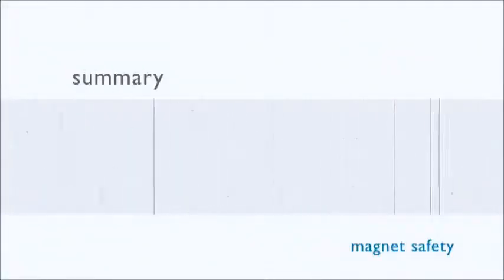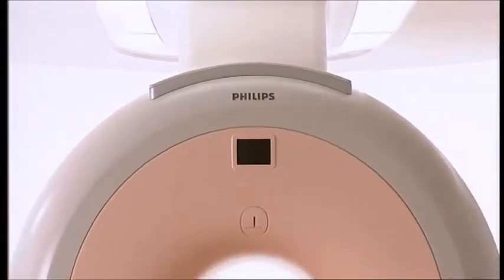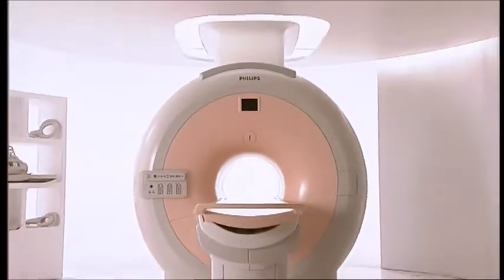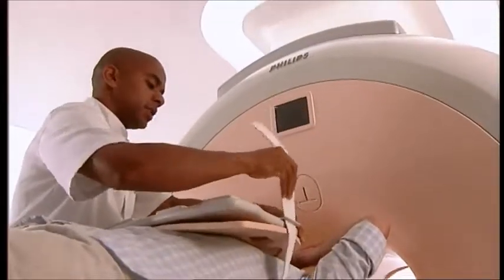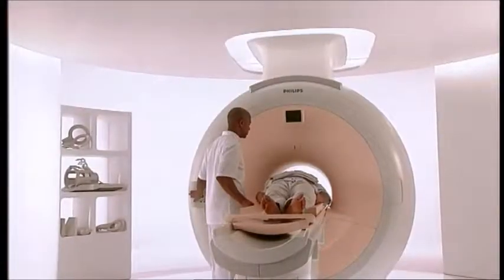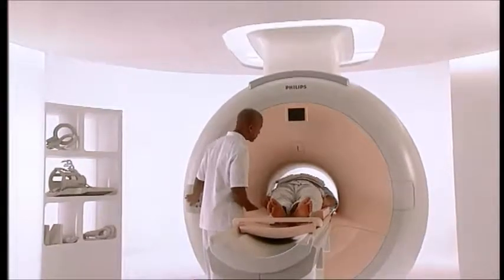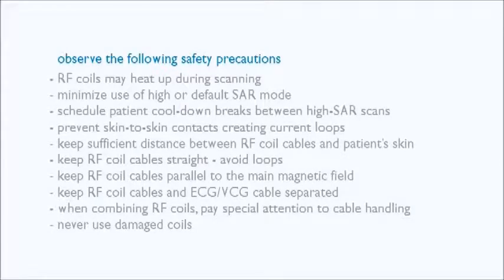Summary. Although MRI is a safe diagnostic modality, there are still some potential hazards, including the possibility of RF burns. Modern scanners have built-in safety features that are designed to prevent this problem. However, as more and more electronic devices are added to the patient, careful positioning becomes increasingly important. Some safety precautions should always be observed.